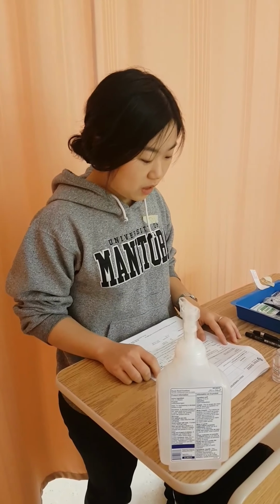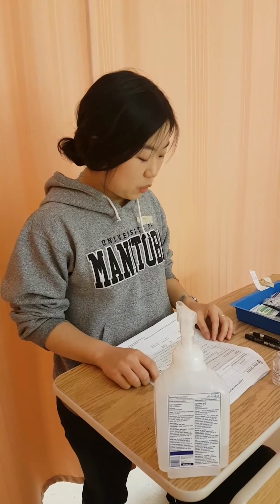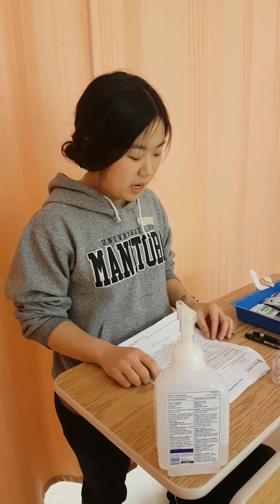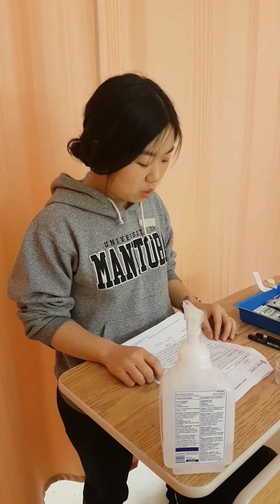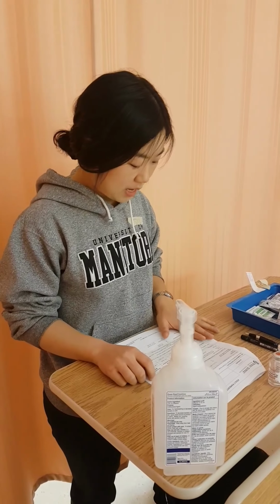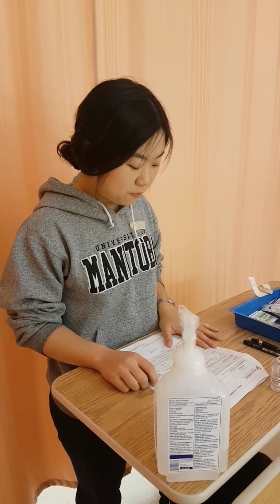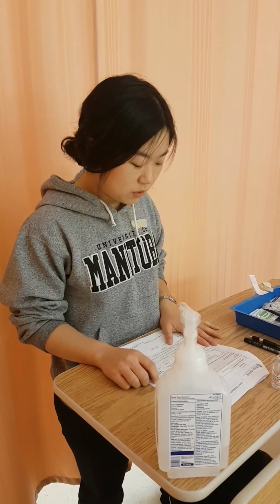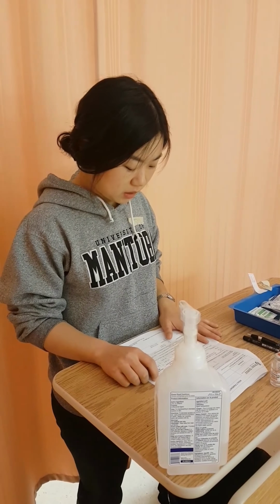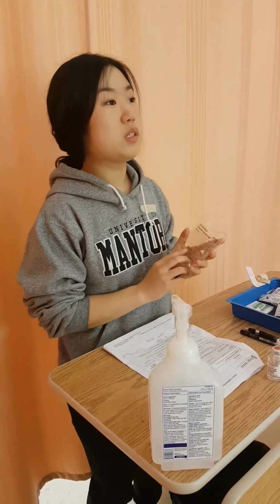And because this vial comes in a powdered form, I need to reconstitute it. So for a 1 gram vial, I need to add 9.6 milliliters of sterile water to get a final volume of 10 milliliters. And I'm giving this IV intermittently, so I need to dilute this in either a 50 or 100 milliliter of D5W or normal saline. And the mini bag that I chose was 50 milliliters of normal saline.